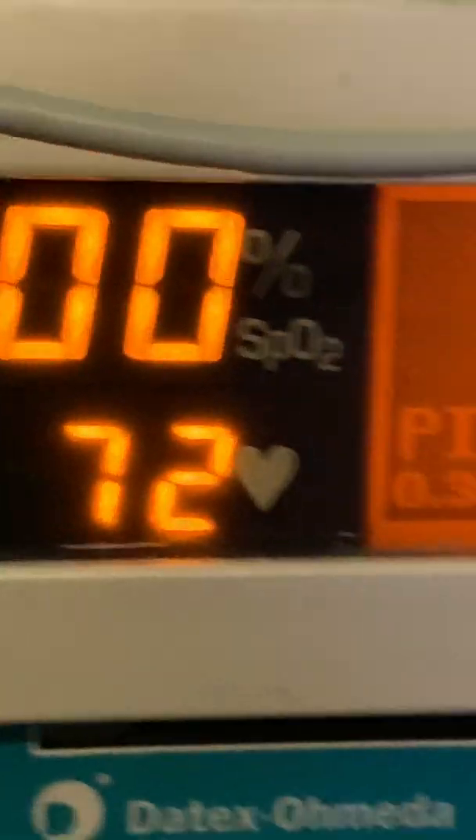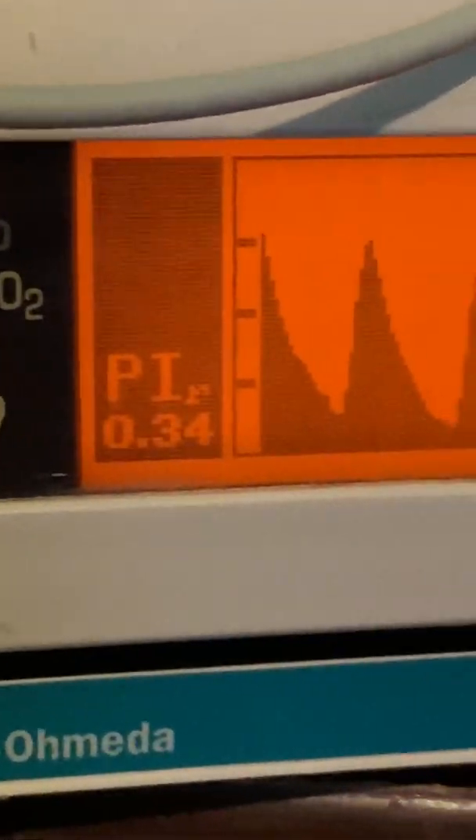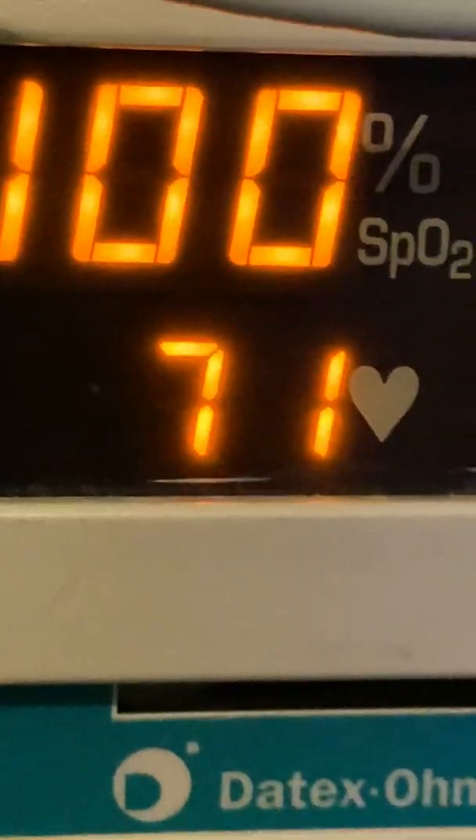I like this so much better than my Massimo Radical 8 Pulse Oximeter. The reason being, it was based on the readings — all of the parameters and stuff. They were displayed in LEDs, and you get better quality with LCDs. So I wanted to get this because that's one thing I don't like about the Massimo Radical 8.